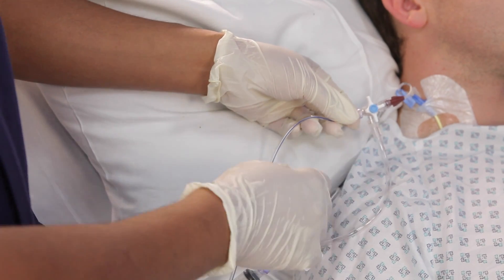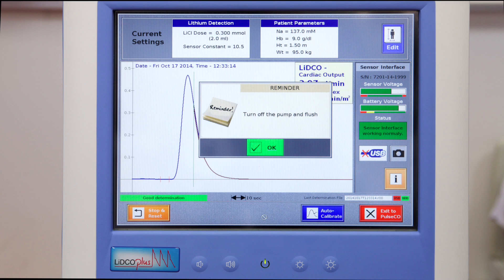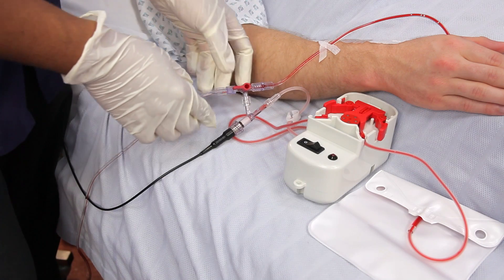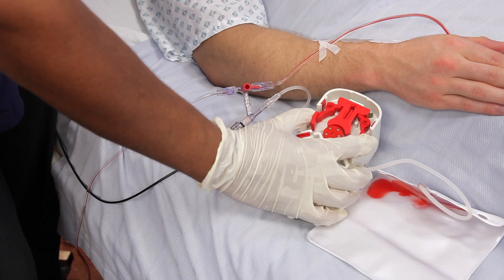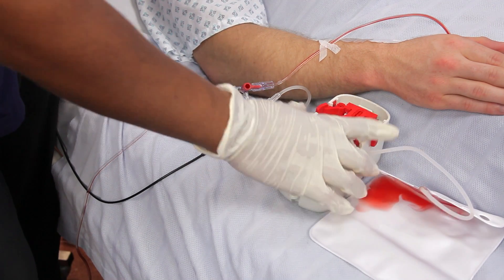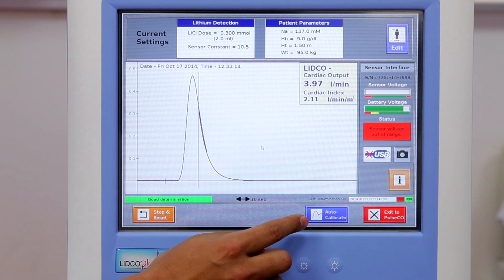You can then close the CVC 3-way tap. The screen will prompt you to turn off the flow regulator and flush the arterial line. To flush the arterial line, just open the sensor to the transducer and flush it with saline. Ensure you squeeze the tension levers on the flow regulator to allow the flow of saline into the blood collection bag. Make sure you flush the arterial line and re-establish the arterial waveform. Calibrate the LitcoPlus with the data obtained by pressing Auto Calibration.